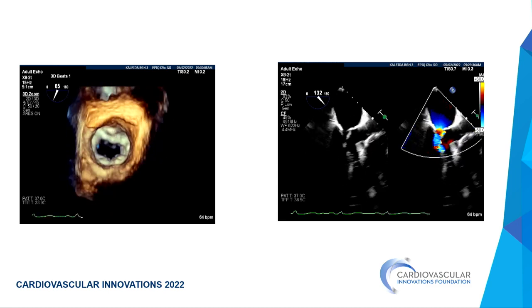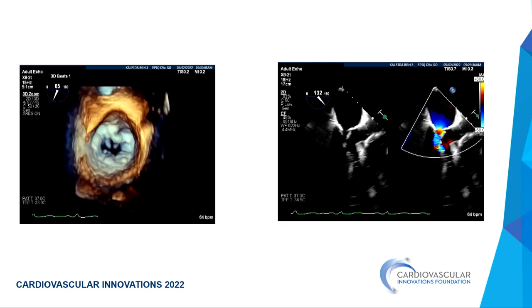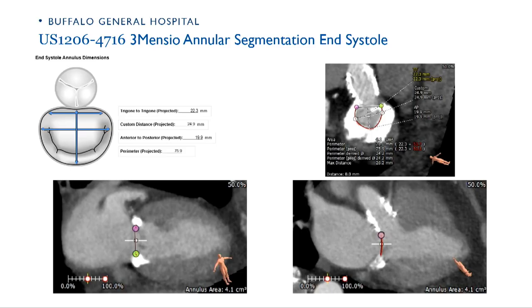All of that portends potential disaster, as all of you on this panel know. But we were running out of options, and we decided based upon our best judgment. This is a little bit of the CT measurements. You can see a lot of MAC. There's a transcatheter valve. A little bit of a septal bulge, but unfortunately not a lot of good septal perforator branches that would be good options for an alcohol septal ablation. So we had to rule that out as an option for potentially preventing LVOT obstruction.